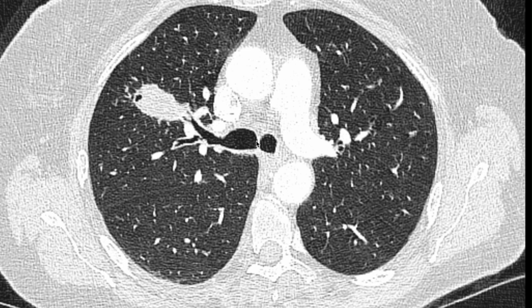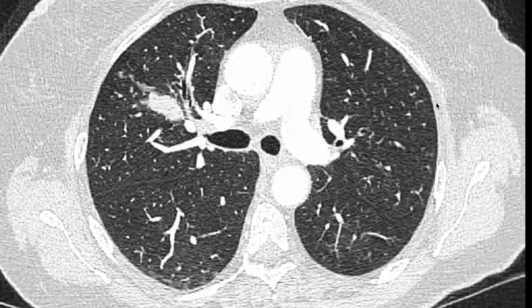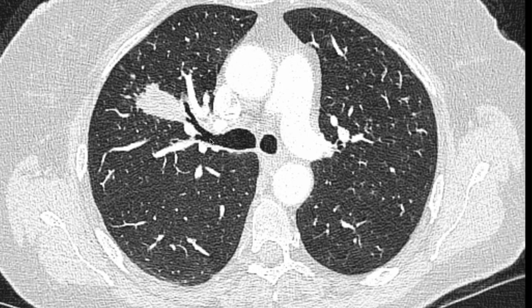So here's the right main bronchus with the main carina. Here's the right upper lobe. Here's the anterior segment bronchus, and it's the first posterior branch. So the anterior segment is RB3, and the first posterior branch will be an A. So RB3A seems to go straight into that lesion. And we can just scroll up and down nicely to see how that goes straight in there.